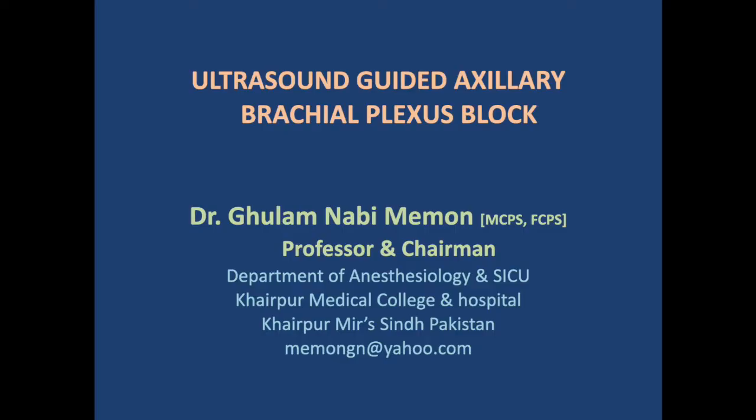I am Dr. Ghulam Nabi Memon. Today I will discuss a case of ultrasound-guided axillary brachial plexus block for hand surgery, in which a wood splinter was stuck in the palmar surface.